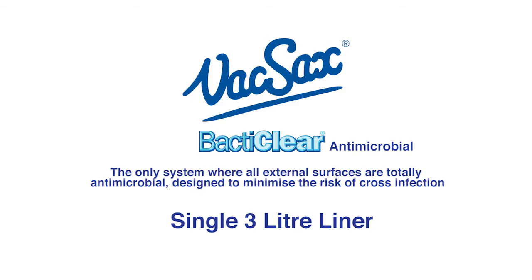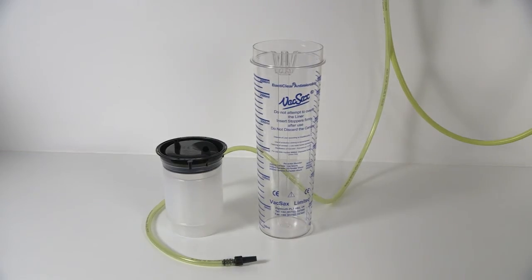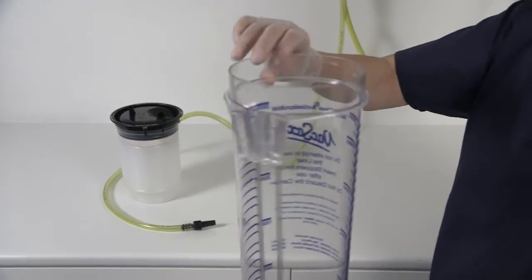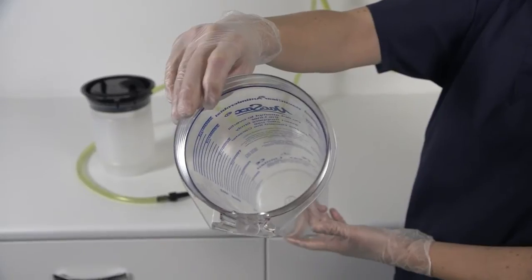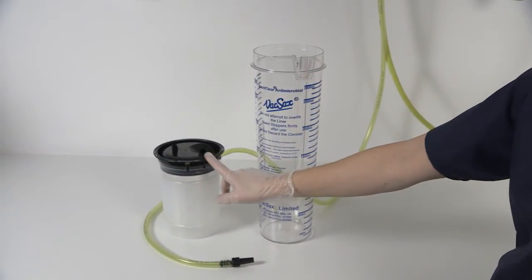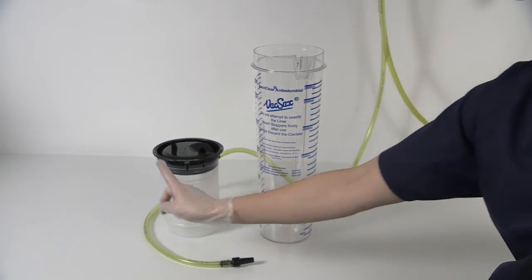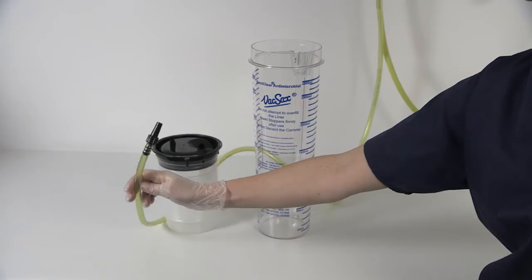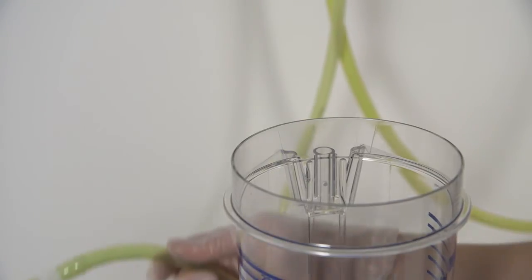The single 3 litre liner. For this you will need one 3 litre canister with rear vacuum port, one 3 litre liner — noting first the vacuum port and then the patient port, which are unique and cannot be misconnected — and a 1 metre length of non-disposable yellow vacuum tubing kit with T-piece.